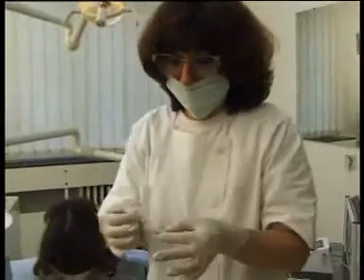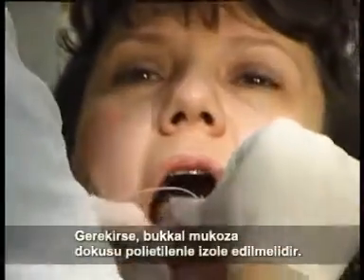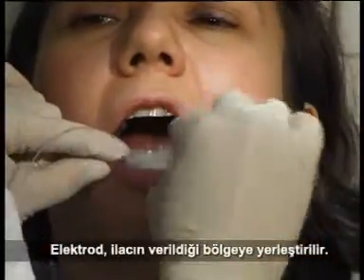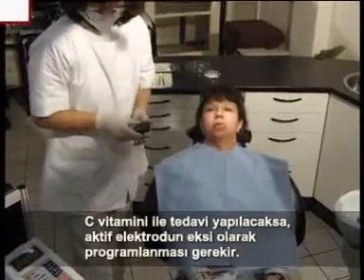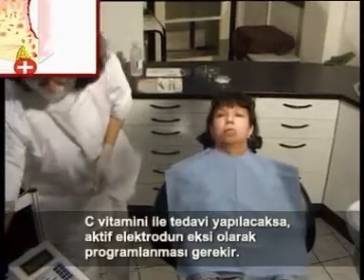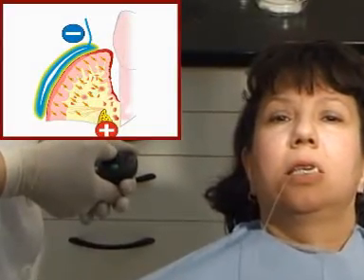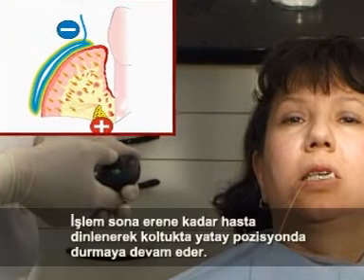If necessary, the buccal mucous tissue is isolated with polyethylene. The electrode is located in the area where the medicine will be inserted. In case of therapy with vitamin C, the active electrode is programmed with negative pole. The patient is left in peace until the procedure ends.